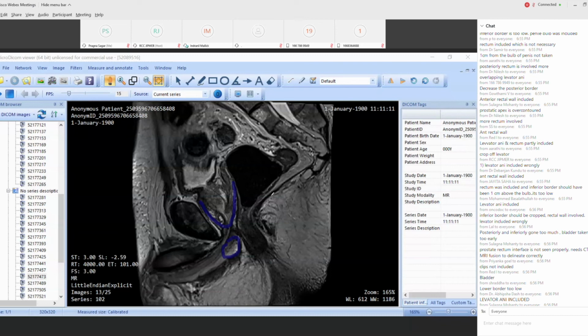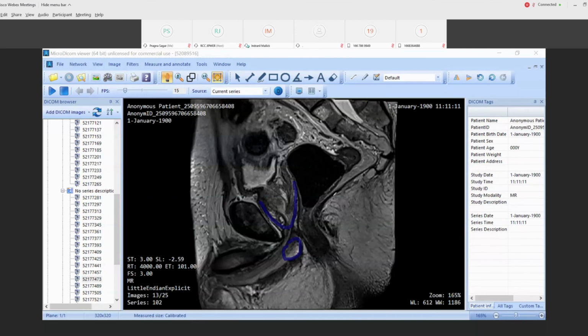Now, regarding whether we can reduce the margin posteriorly. When we do SBRT of the prostate, we keep a 5mm PTV margin. For SBRT of the prostate, it is important that there is a verification of the image guidance by a more experienced person, usually a doctor.